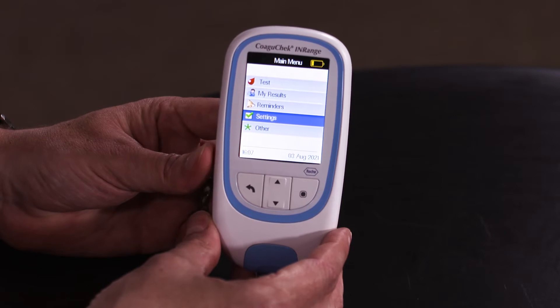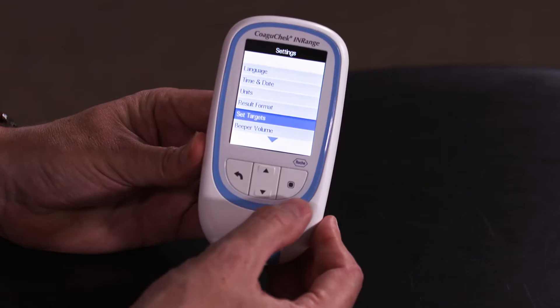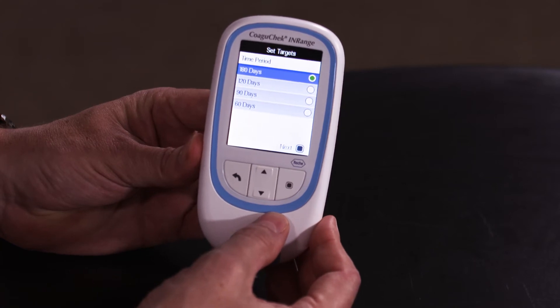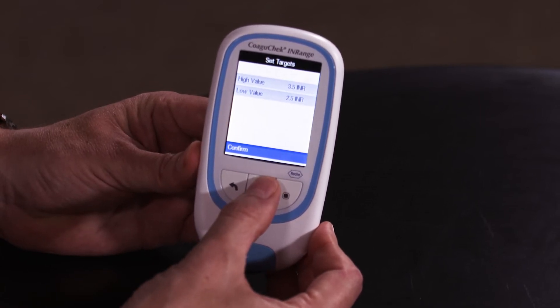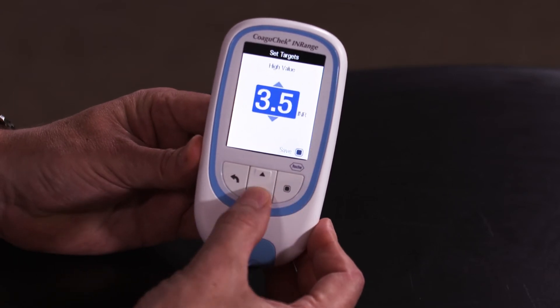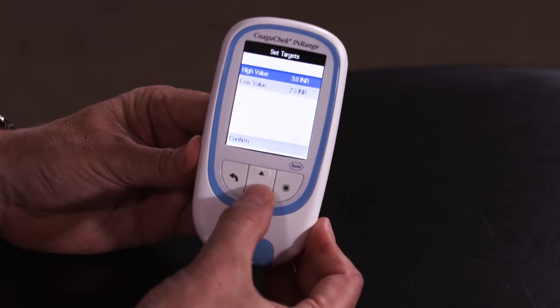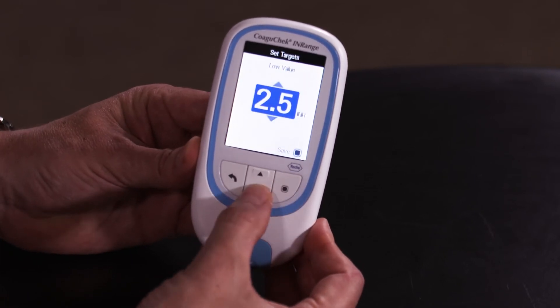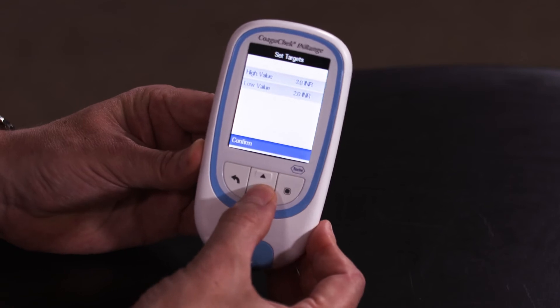In settings you can select your therapeutic range. Select set targets, enter your time period, and enter your therapeutic range as advised by your healthcare professional. Once you have set your ranges press confirm.